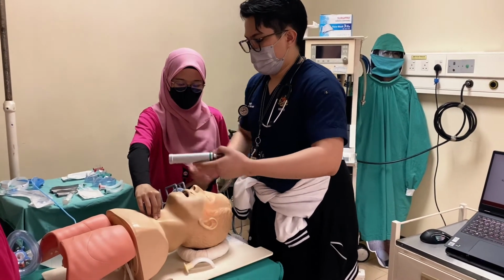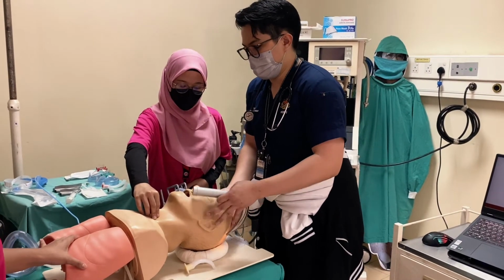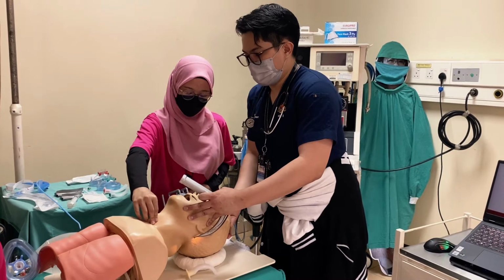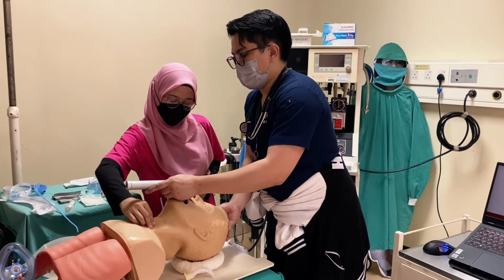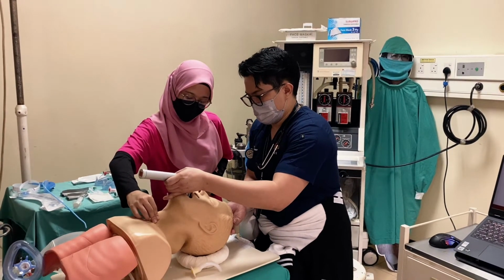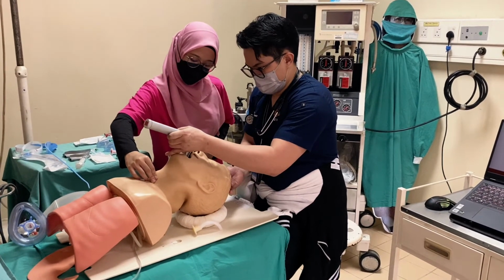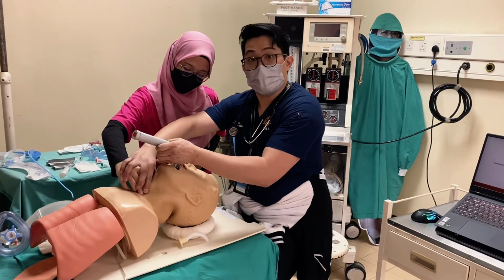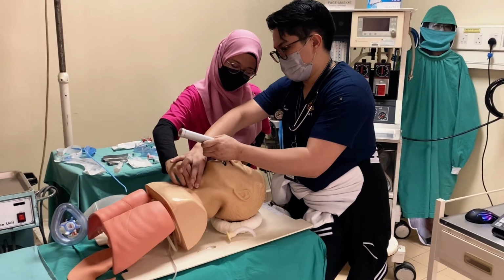Now, after the Sellick maneuver, this is our sniffing position. We will do a bit of jaw thrust, head tilt chin lift to the patient. We do swiping of the tongue, as we do it, you see it. For instance, like this, we ask our assistant to manipulate, to be an example. Okay, for instance, he can provide it.